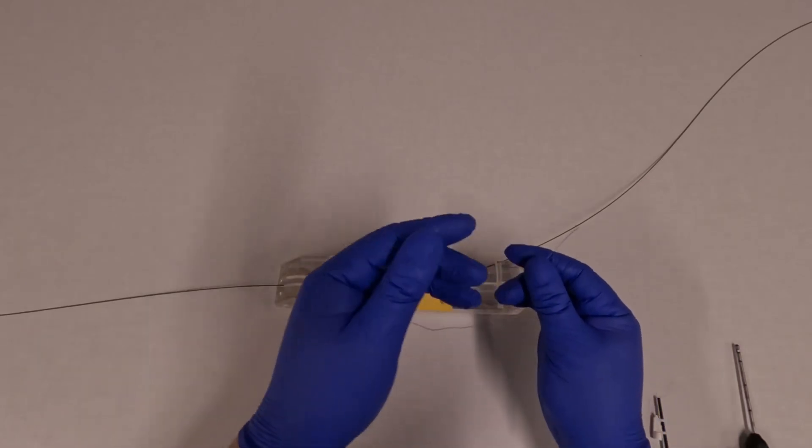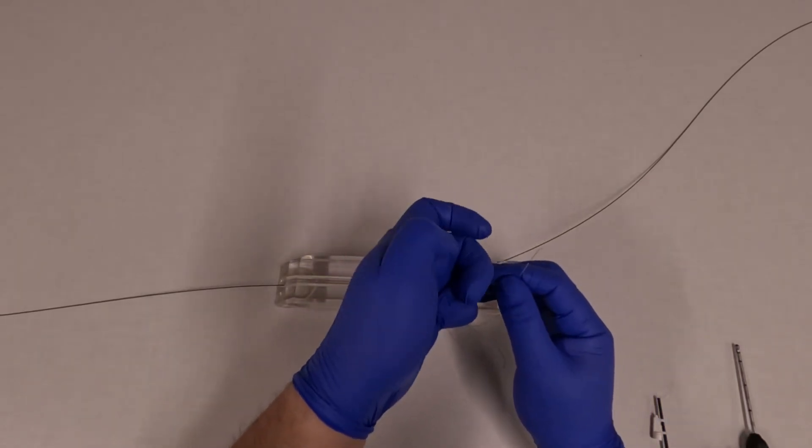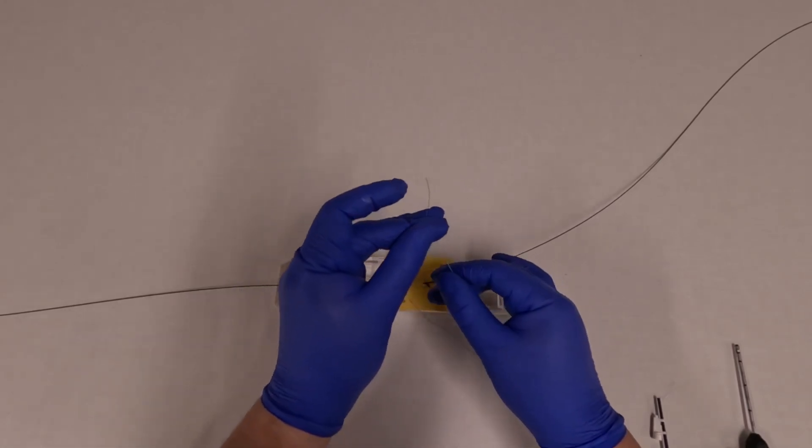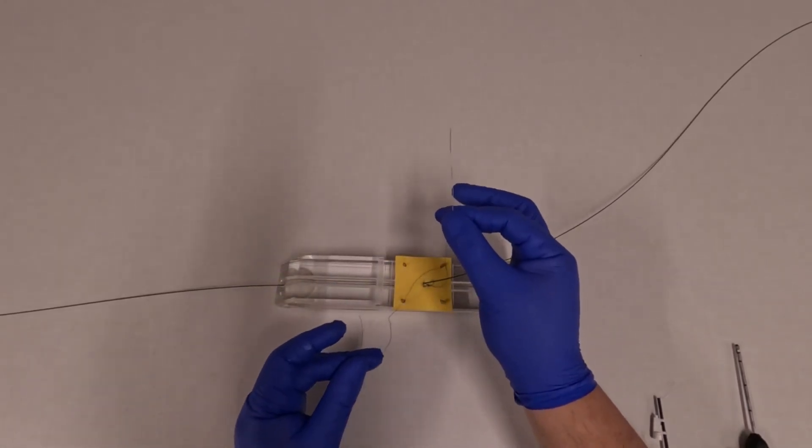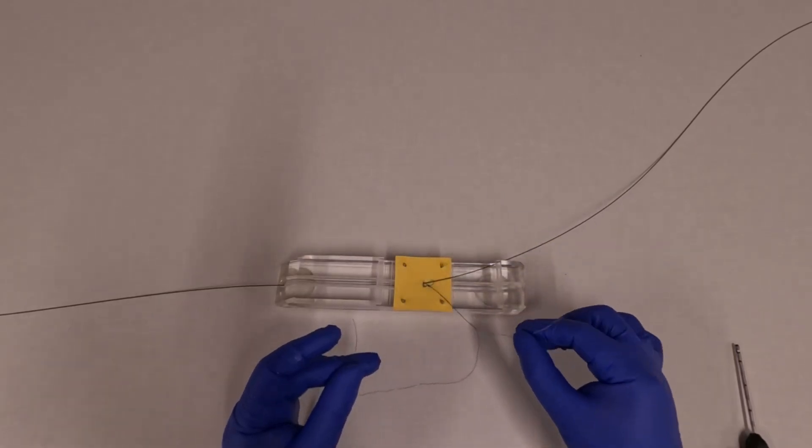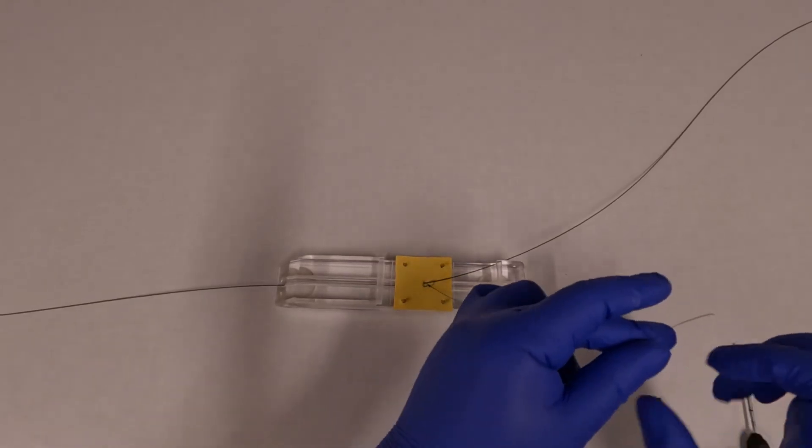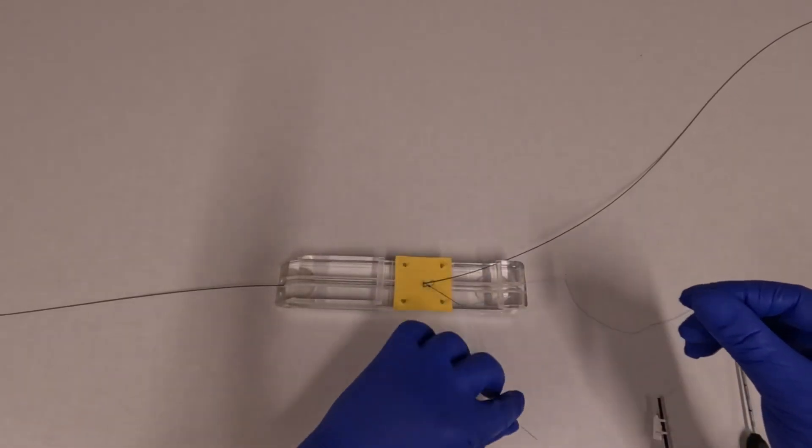Now there are two different sutures that are on this device. One is a blue suture as you can see here. The second arm has a white tip, so we call that the white suture. That's for locking the suture down, so we need to save that until later and make sure you don't pull it too early.